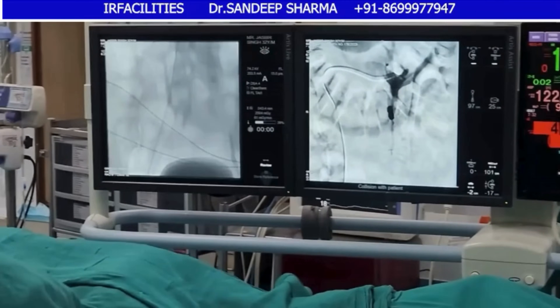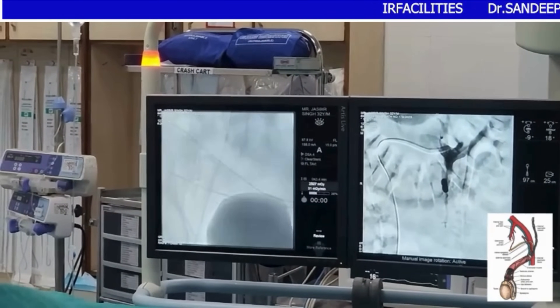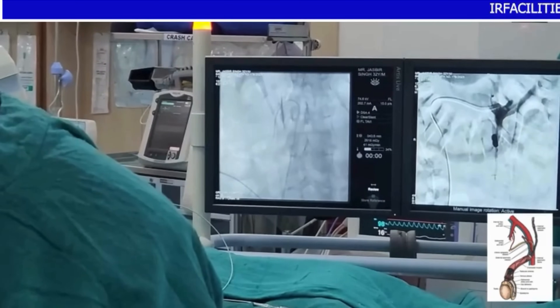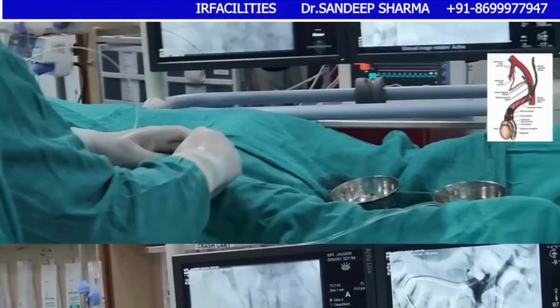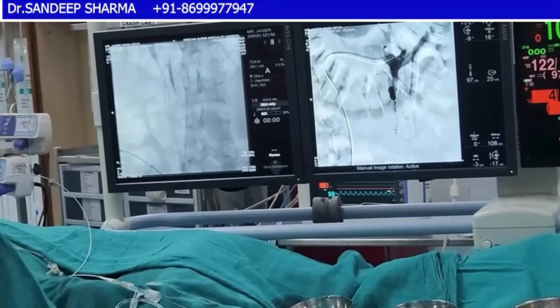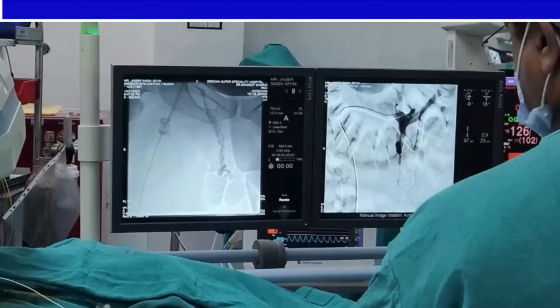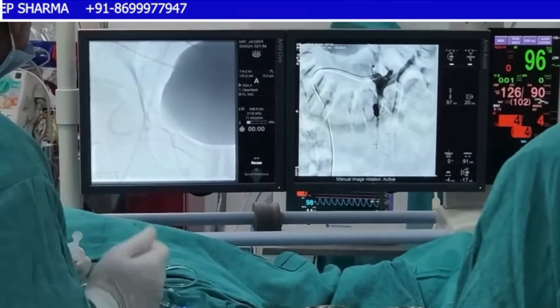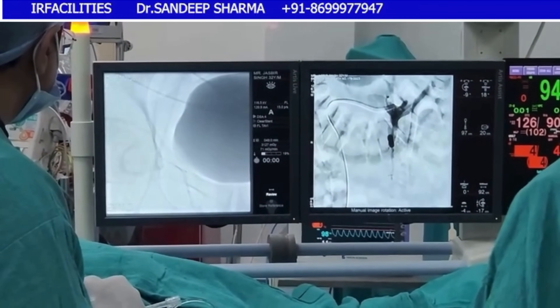Finally we move to cover the left renal vein and try the right side first. The right side was relatively high grade as well and we found the testicular vein, so we take it on. We are now embolizing the right testicular vein - it is a high-grade varicocele. We have hooked the right testicular vein and demonstrated it with contrast. You can see the varicocele on the right side, and if you tell the patient to push - Valsalva - you can see more reflux.